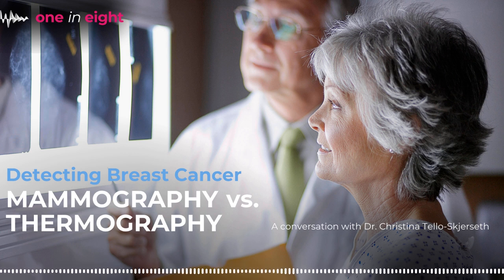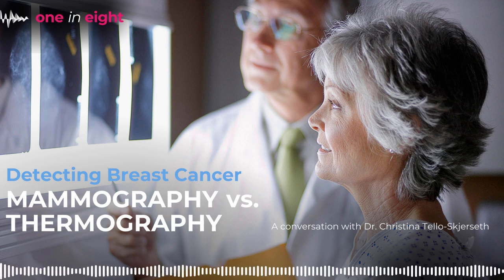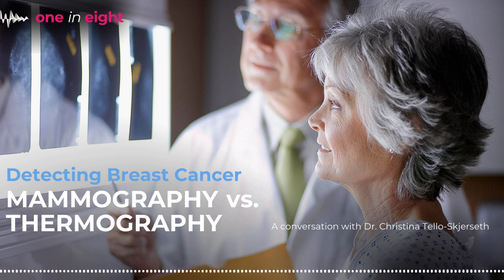Mammography is extremely regulated by the government, by the FDA and MQSA, which is the Mammography Quality Standards Act, since 1992. So there are a lot of guidelines, rules, and certifications we have to stick with and follow every 3 years to make sure that our equipment is appropriate, our technologists are up to date, and the radiologists, and how we interpret exams, even the language we use in the reports. It's all standardized and very regulated. So everyone across the U.S. should be doing it the same if they're certified in mammography. Thermography really has nothing like that.